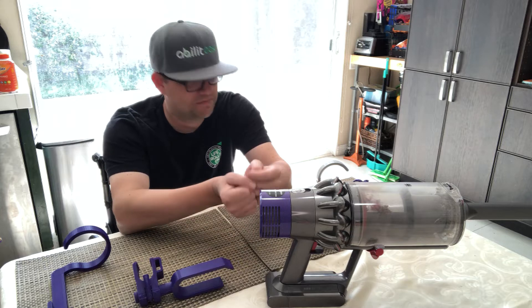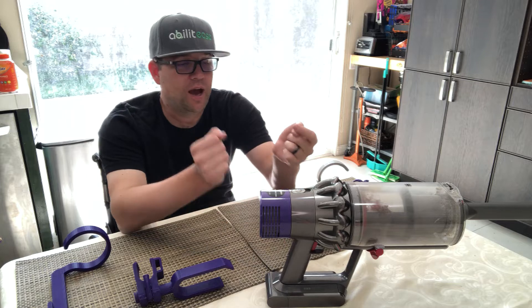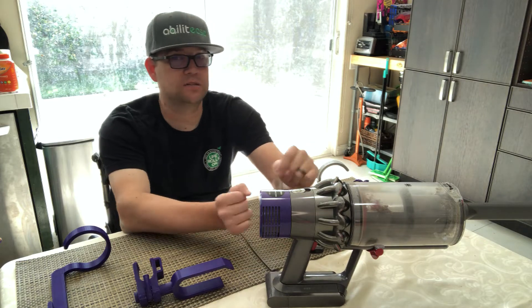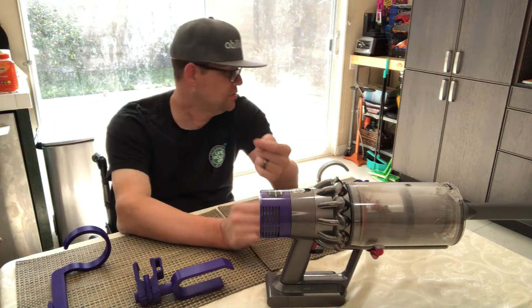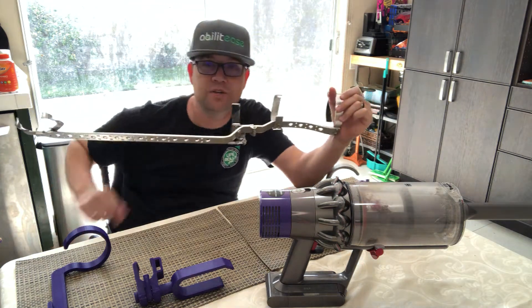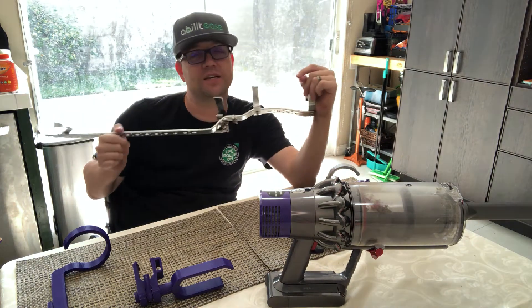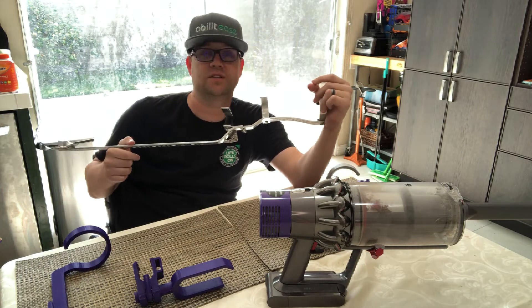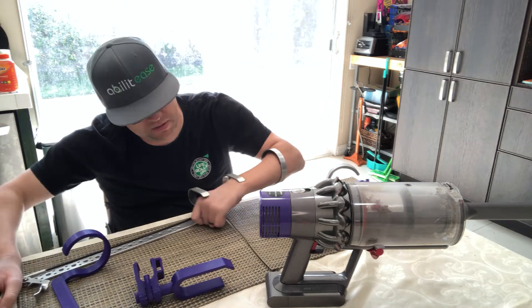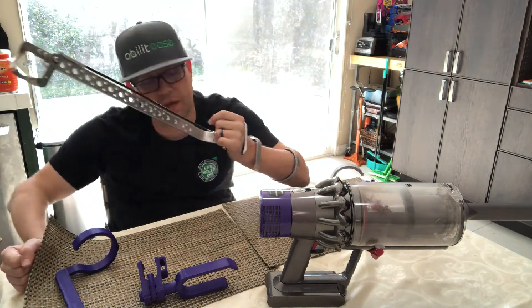My passion drove it and it came to life. I thought: how can I hold this vacuum and still engage the trigger so I can move my chair? My first thought was a product I use every day — the reacher from Quad Tools. As a C5-6, more specifically C6, I have wrist extension and I can use this really great product.